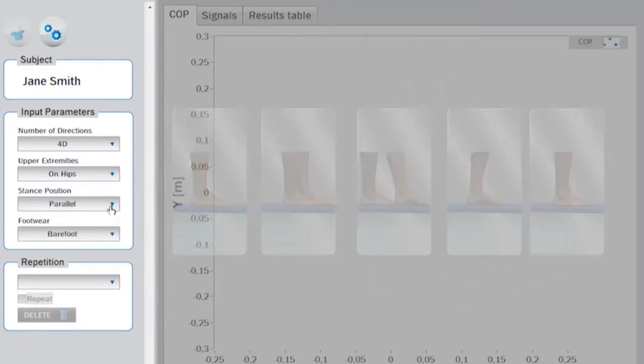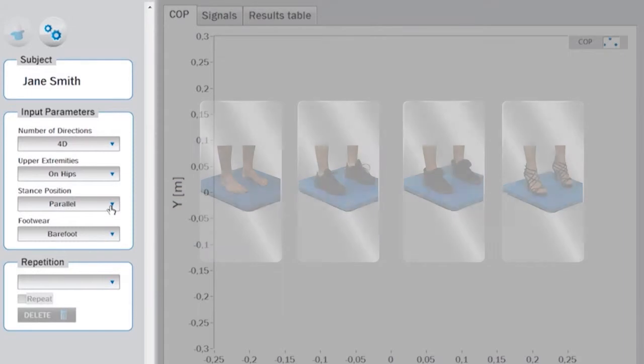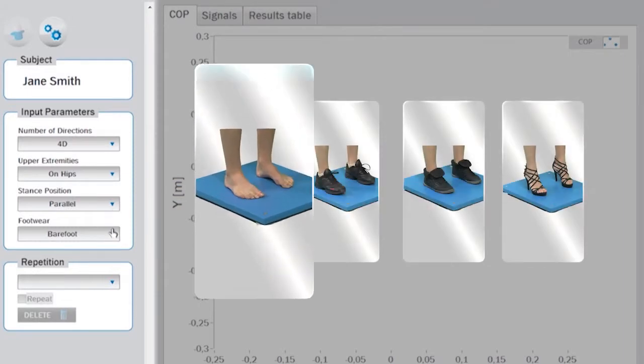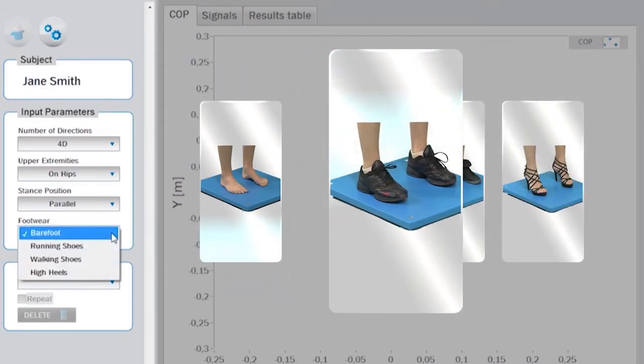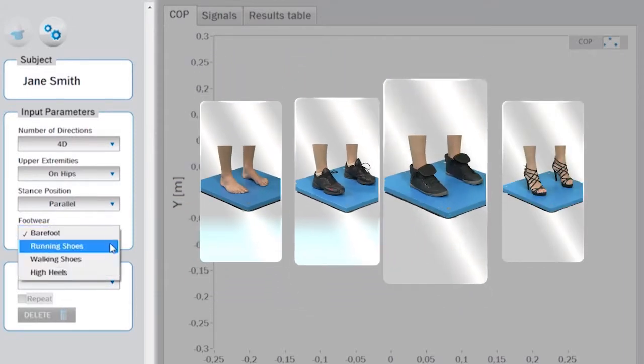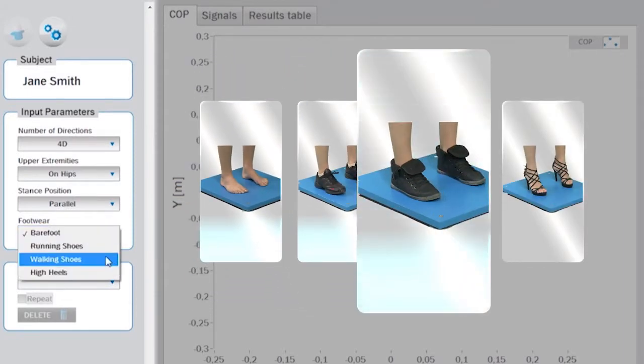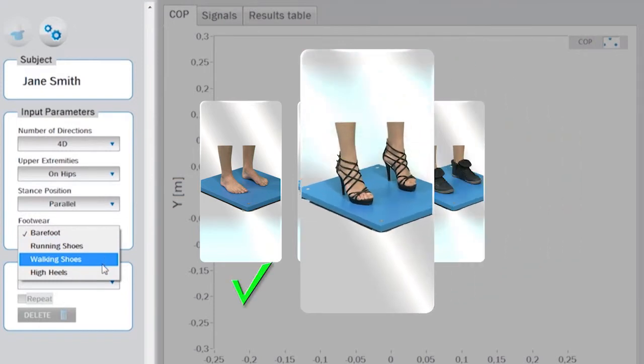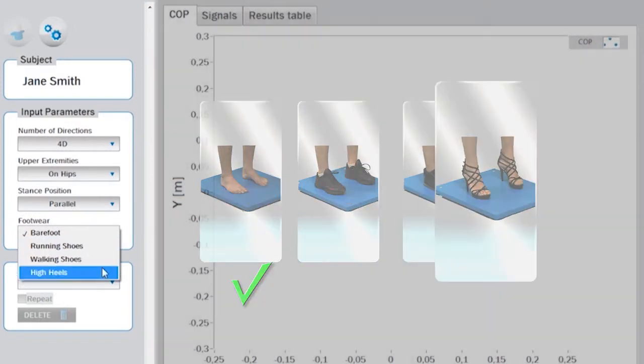To define the footwear, you can choose among barefoot, running shoes, walking shoes, or high heels.